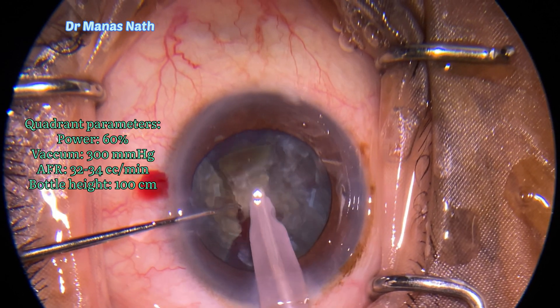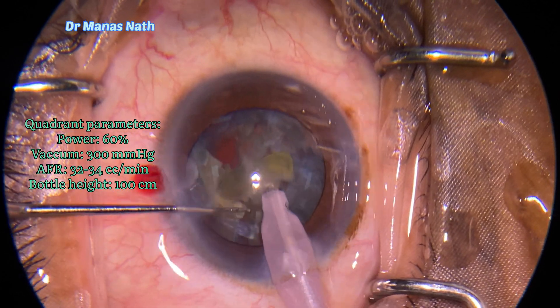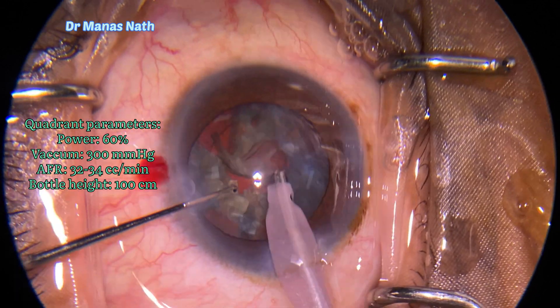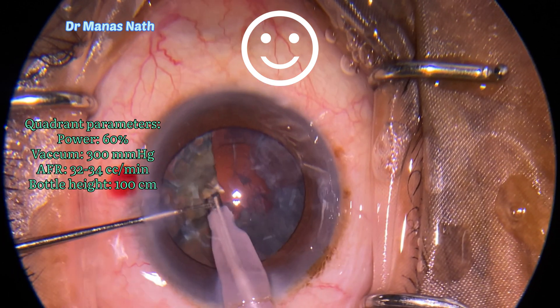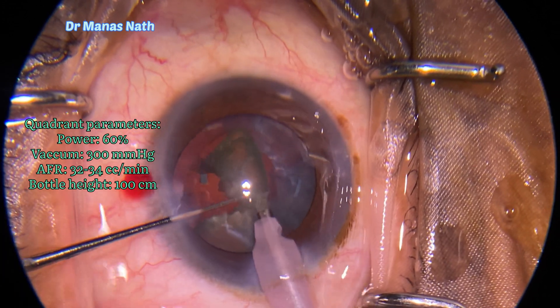Continued with lower parameters with quadrant settings — you can see that I have reduced all the parameters here. After taking out the pie, I was now sure that the posterior capsule was intact. The punch defect was going through the nucleus only.